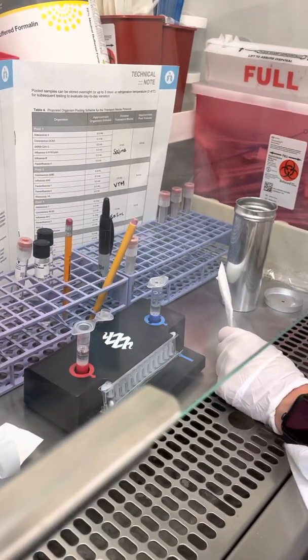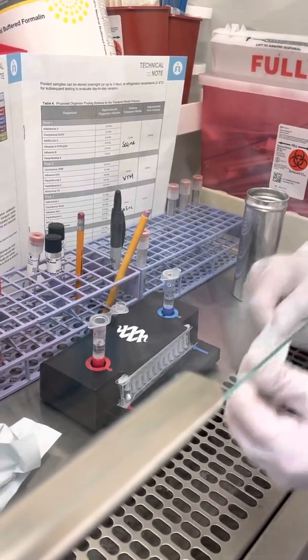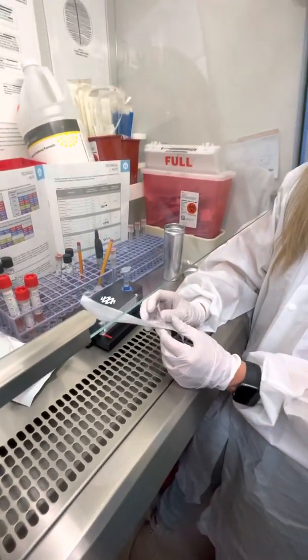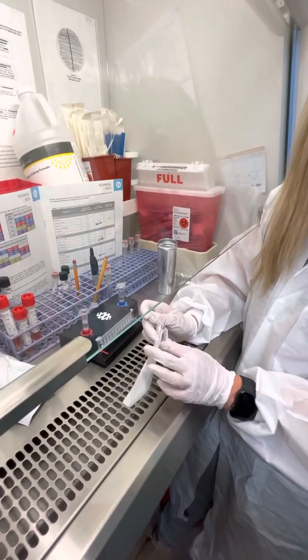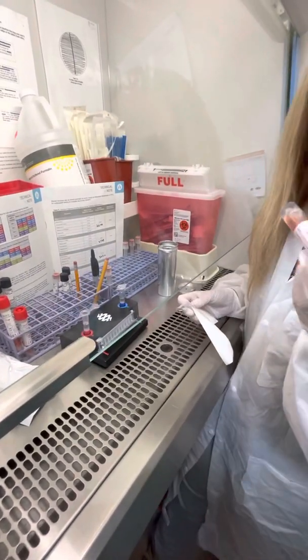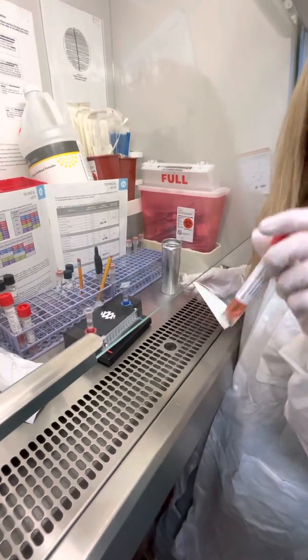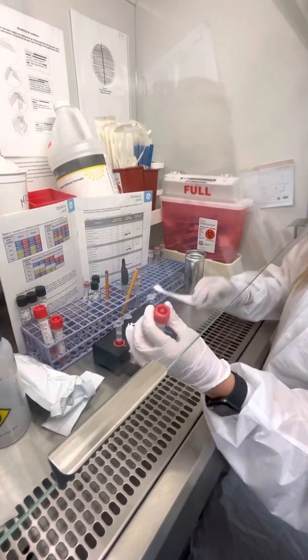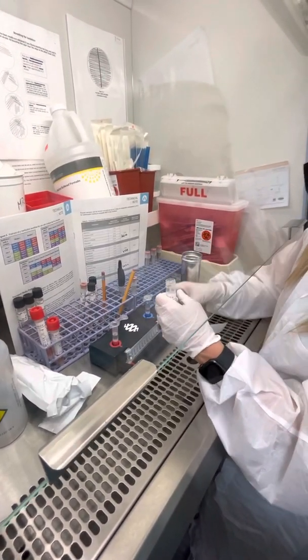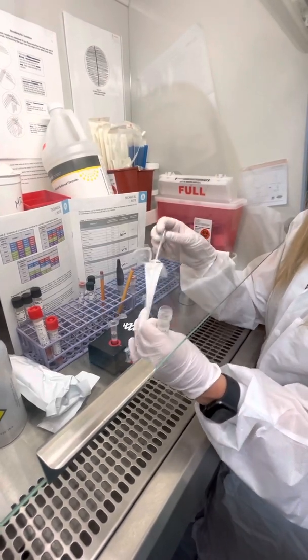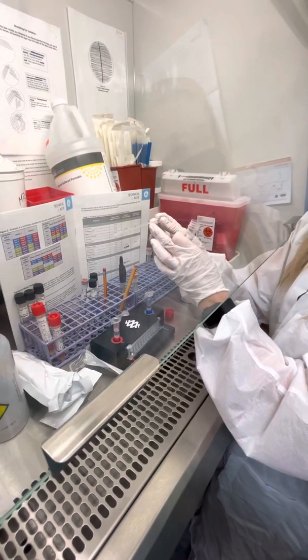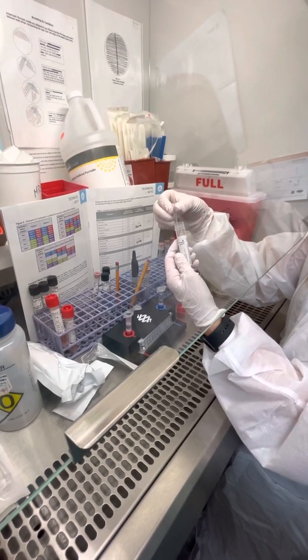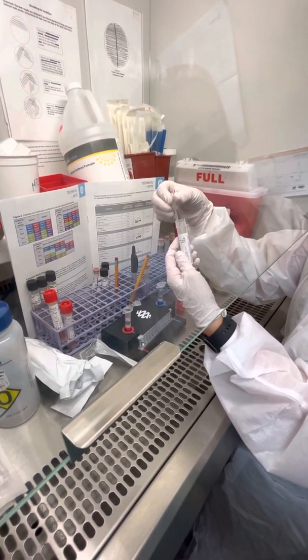Next is your sample. Your sample should be a nasopharyngeal swab in viral transport or saline. Let's pretend that this is a nasopharyngeal swab in my viral transport. You can vortex it or invert really well. Respiratory requires 300 microliters, so you're going to draw up to that third line on your pipette.